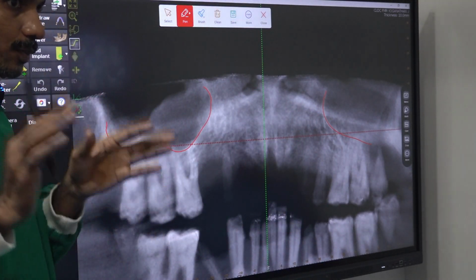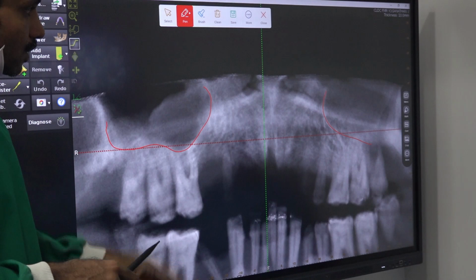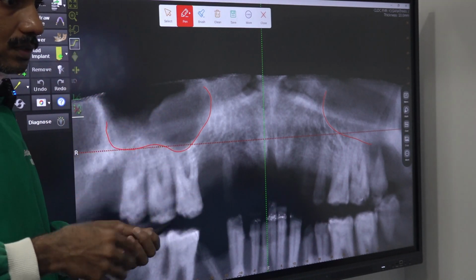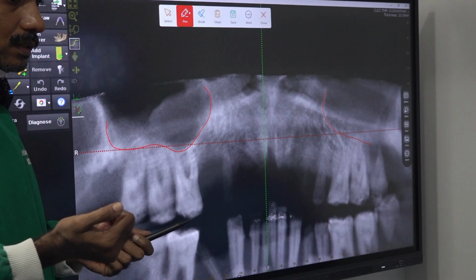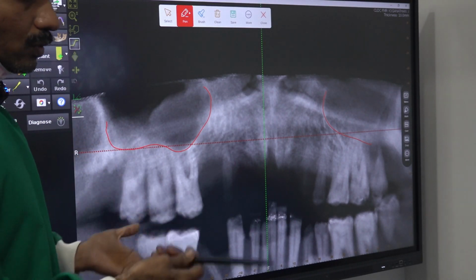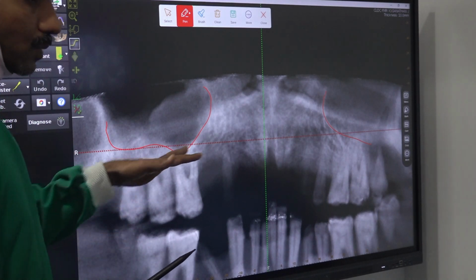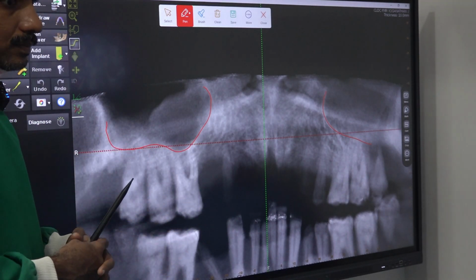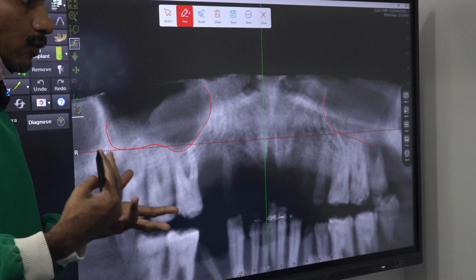That is a separate topic: how to avoid pterygoid. Because the moment you put an implant in pterygoid, the angulation of the abutment is erratic. You have to bend, and if the stability is not good, while bending it may fail. So you have to go to multi-unit. So as much as possible we try to avoid pterygoid and finish. But sometimes pterygoid is a must. Some pterygoids are helpful to avoid zygoma.